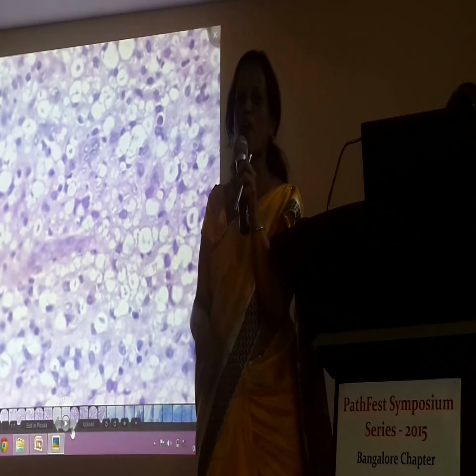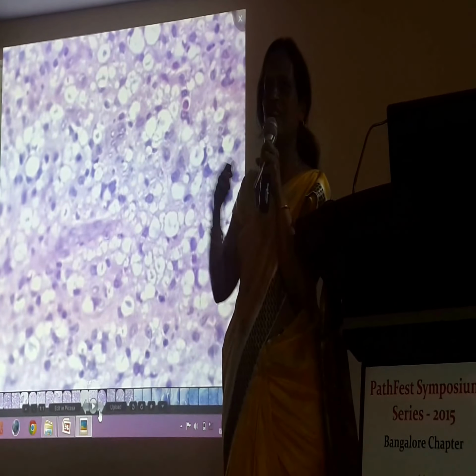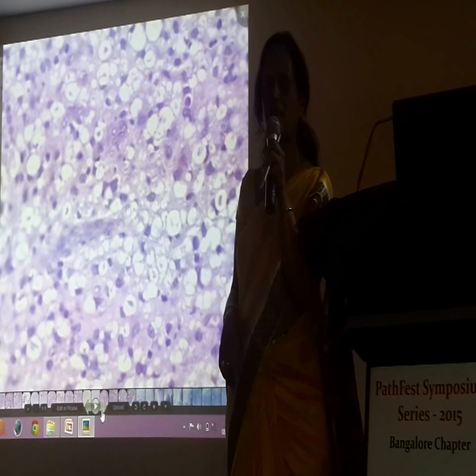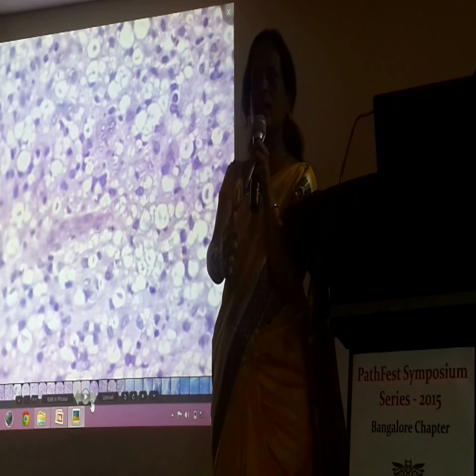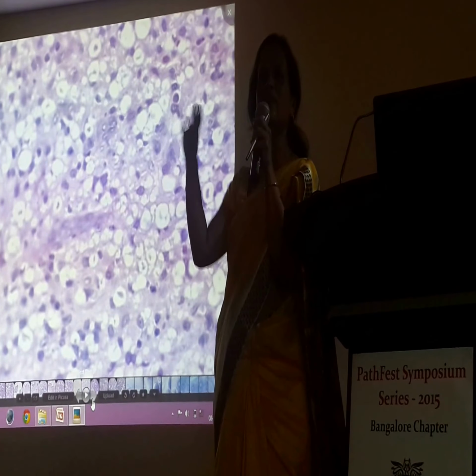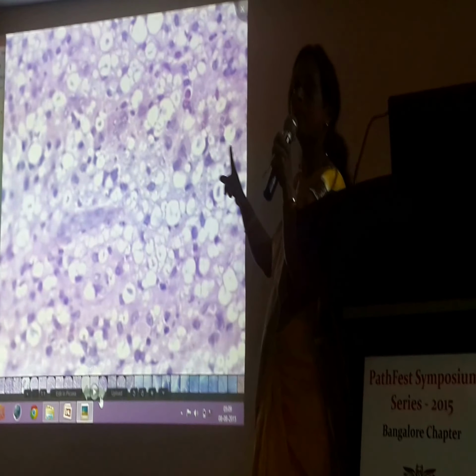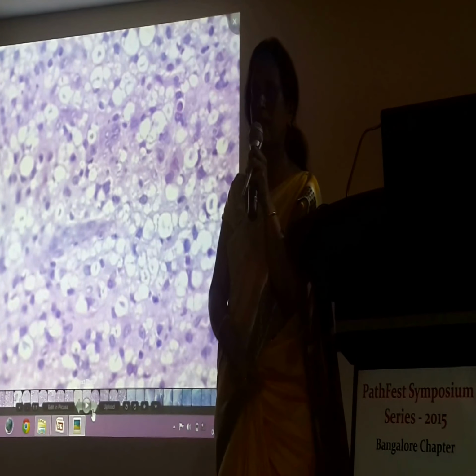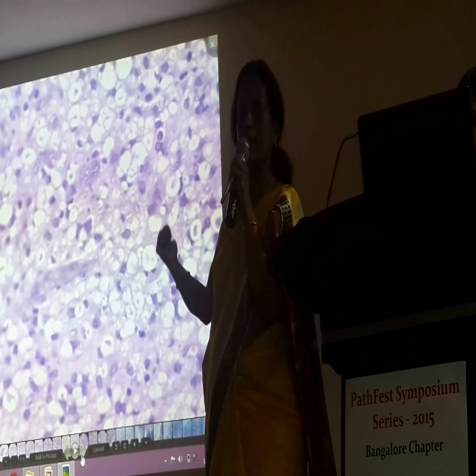I told you this patient had gone to a surgeon. The surgeon happily excised the lymph node and sent it. Now how do we proceed further? Now I have seen this morphologically, and what do I do next? So the tissue is with me. I have something that is being done in the laboratory, then go and examine the patient. So the patient typically had skin lesions. And there were areas of necrosis. There are a lot of case reports that say that tuberculosis and leprosy could be seen together in a lymph node. Or it could be borderline where even the epithelioid cells could be there.